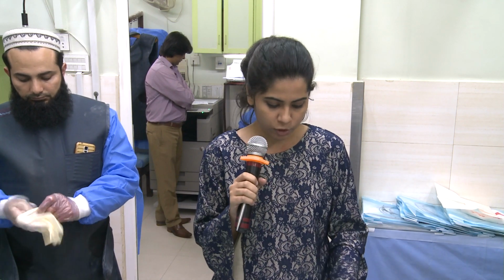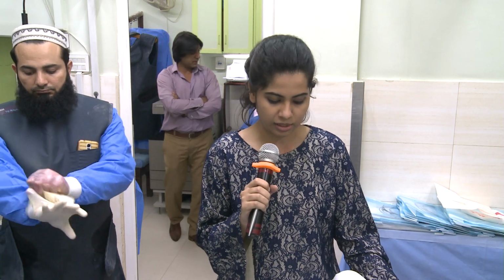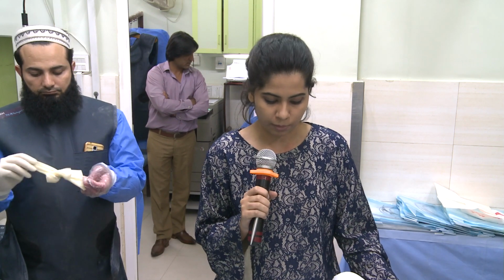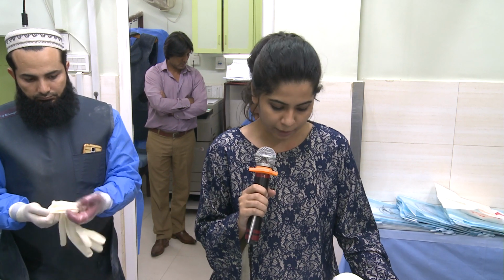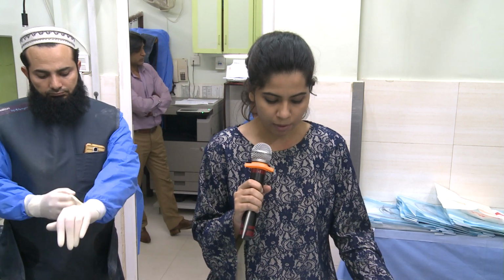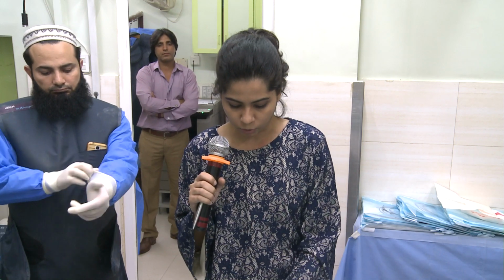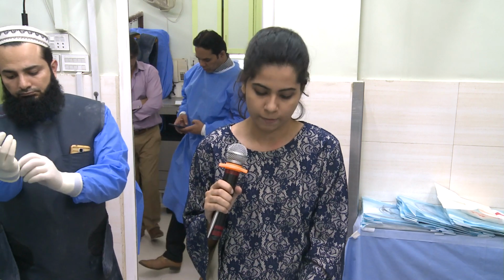This MRCP was followed by an EUS done on 21st March that says CBD appears dilated at 8.1 mm, no stones seen in the CBD and no mass seen in the ampulla or periampullary region. Pancreas and pancreatic duct also appear normal. Rest of the visualized viscera also appear normal. So ERCP was advised with the impression of papillary stenosis. Her current LFTs are within normal range with a total bili of 0.26 and alkaline phosphatase of 108.